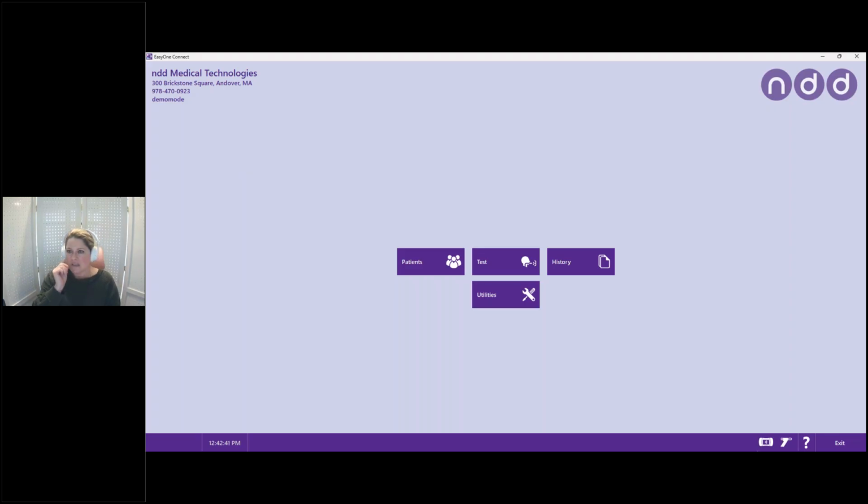All right, I'm going to stop sharing that for just a second and hop quickly over to EasyOne Connect. EasyOne Connect is our PC software. You can utilize this for data management.